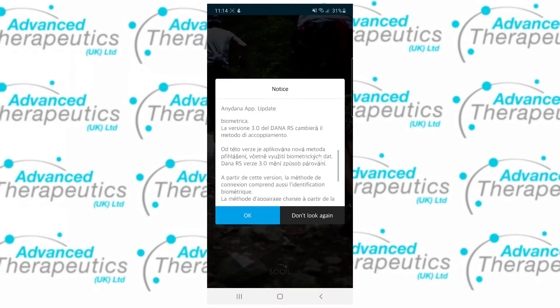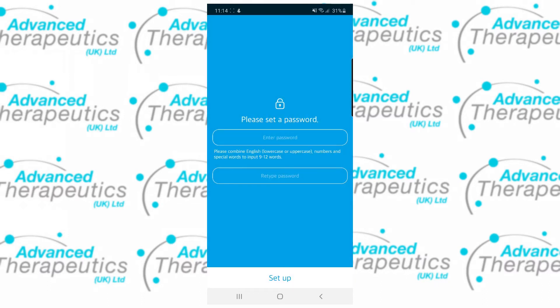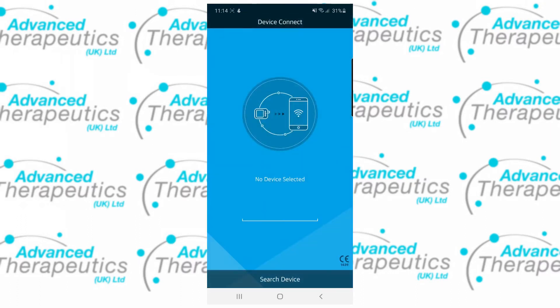You may receive a notice of an update before being asked to set a password. The password must be between 9 and 12 characters with both lowercase and uppercase, numbers and a special character. We recommend using biometric authentication for quick access to the app.